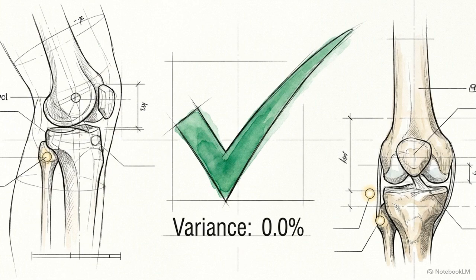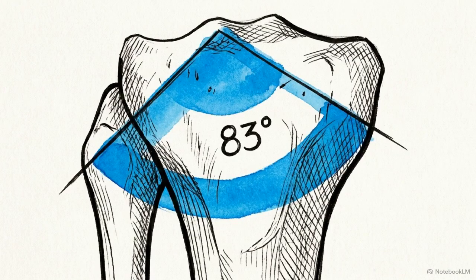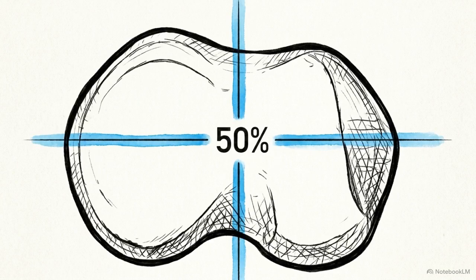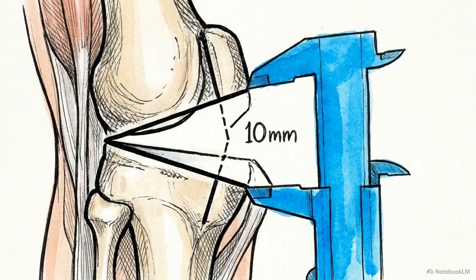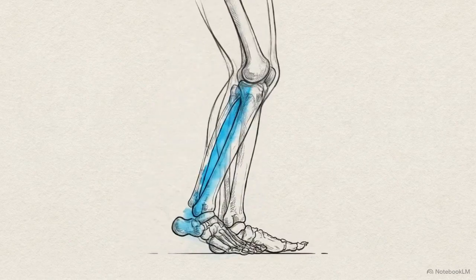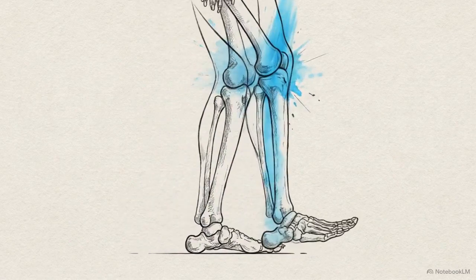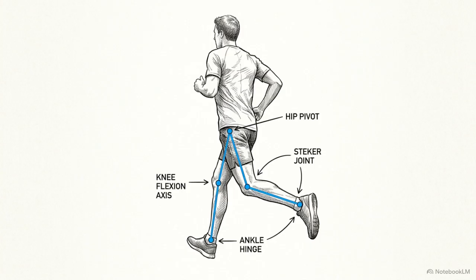Standardizing the mapping of landmarks digitally eliminates the human variance that historically caused overcorrection or undercorrection in osteotomies. The workflow requires strict sequence: mapping the metaphyseal anatomy, defining the 50% target vector, calculating the Miniaci rotation, and deriving the exact wedge width. Adhering to this rigorous sequence is the only way to successfully shift the load from the medial to the lateral compartment without violating the horizontality of the joint line. By treating preoperative planning as a strict geometric derivation, surgeons guarantee that every degree of planned alignment translates flawlessly into structural, clinical reality.